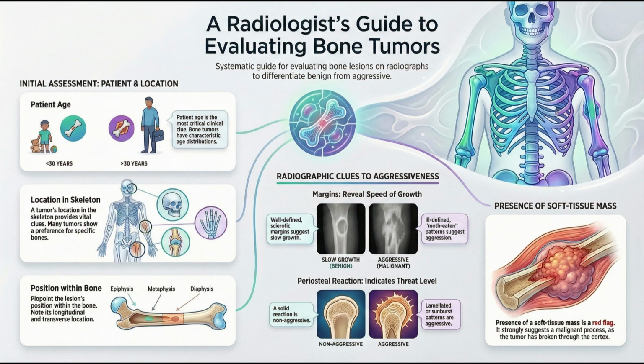Welcome to the Deep Dive, where we take clinical sources on these really complex subjects and we basically extract the vital knowledge. We give you the blueprint for being instantly well-informed. And our focus today is on something that seems deceptively simple, the conventional radiograph. The humble X-ray. Exactly, and specifically how it's used to evaluate a suspected bone lesion.